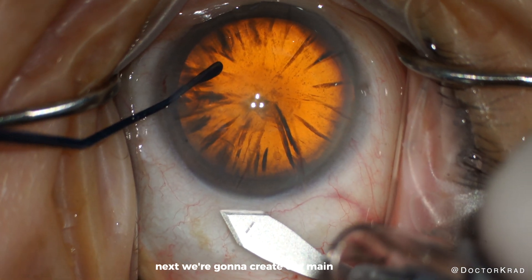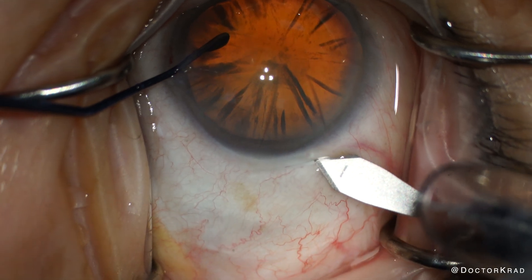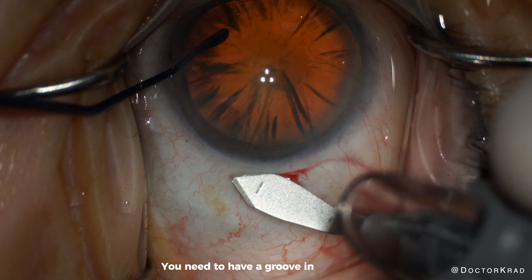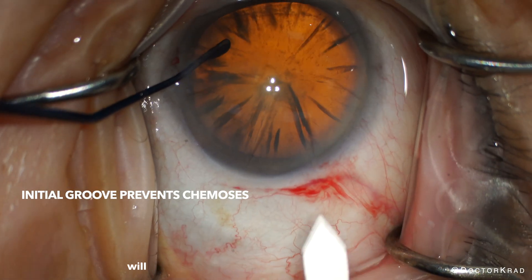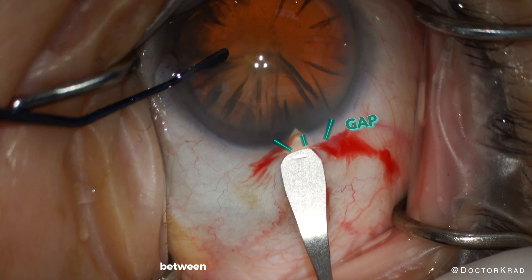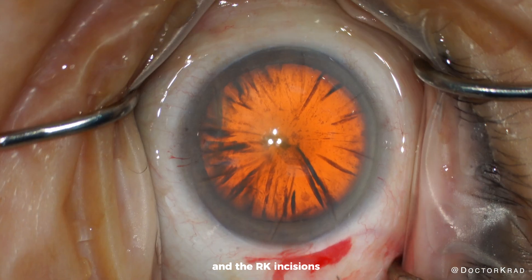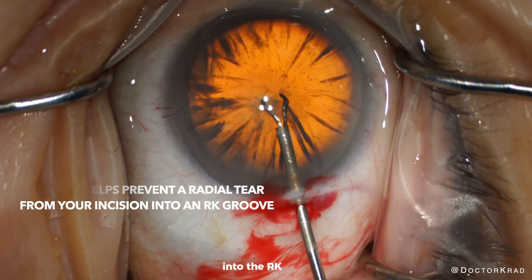Next, we're going to create our main incision and we want it at least a millimeter back from the limbus. Make sure you don't just go through the conjunctiva — you need to have a groove in the sclera. Cutting the conjunctiva wider than your incision will prevent swelling or chemosis of the conjunctiva.